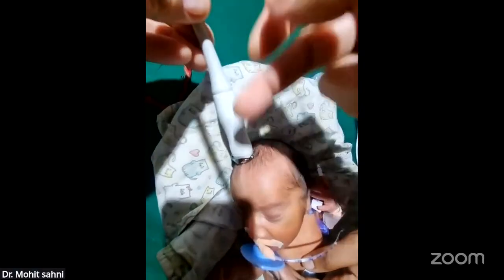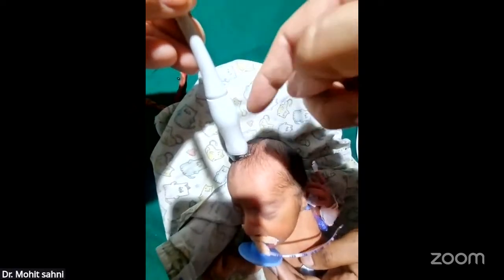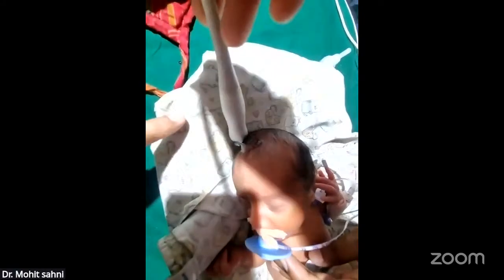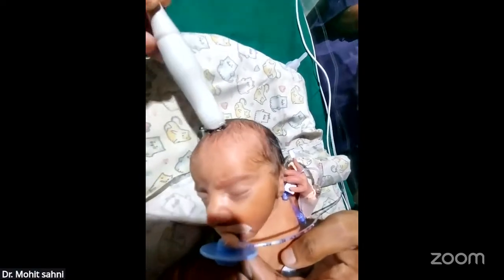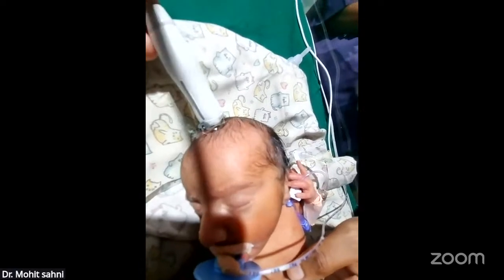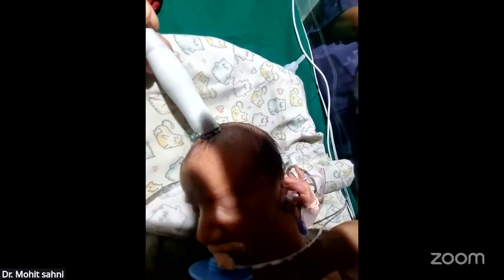If this is the clock, here will be the 12 o'clock, 6 o'clock, 3 o'clock on the left, and 9 o'clock on the right. So I'm putting the probe on the baby's AF, anterior fontanelle, with the pointer pointing at 9 o'clock, that is toward the right side.